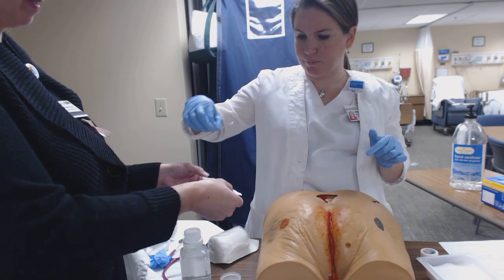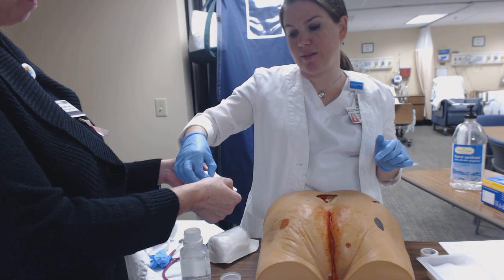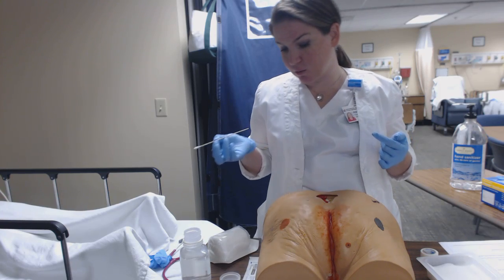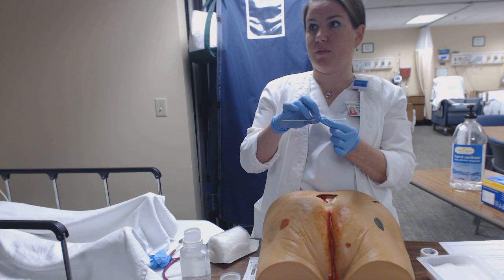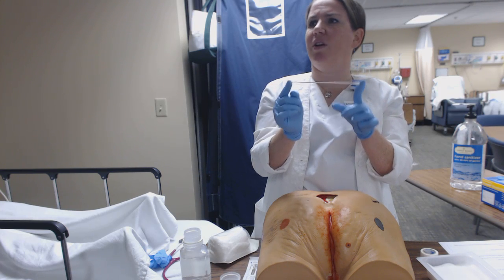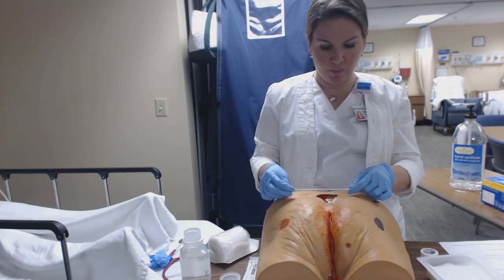And how is this measured, Miss Canby? In inches? No, in centimeters. Because this is 5.5 centimeters. Hopefully we don't have a wound that's 5 inches. Because what does 5 inches look like compared to 5 centimeters? Oh, that's good critical thinking, I think. Yeah, so this is 5 centimeters, and this stick is probably 4 or 5 inches, I would say. So just kind of think about that whenever you're doing your measurements.